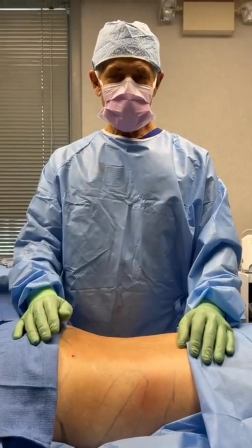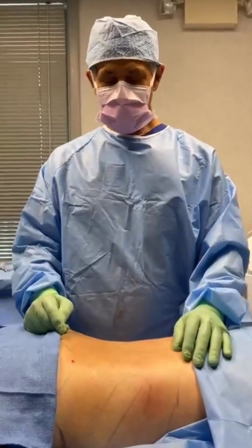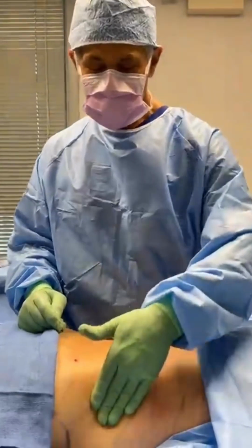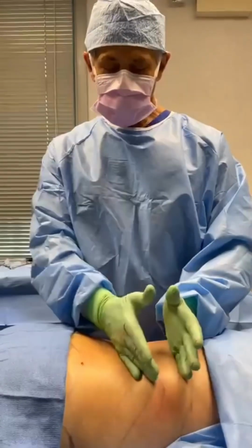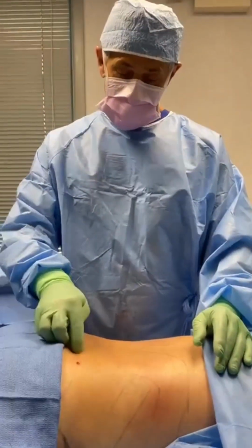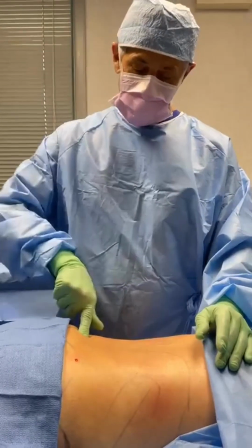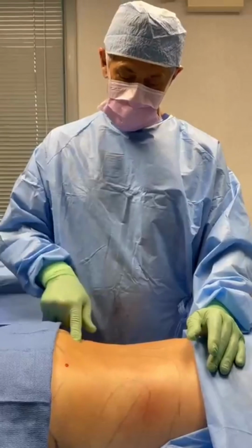Milford MD, this morning's project, you remember, is the Lipo 360. We lipoed on the front, sculpted the waist so they're curvy in now, and sculpted the lower back that's above the hips, so that the hip area. And also there are a couple little areas we marked here for some nice little divots, some dimples.